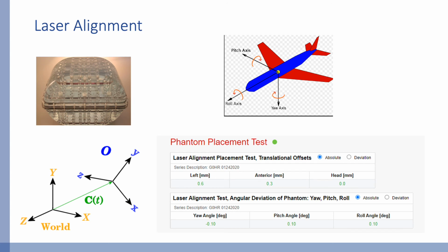The phantoms are equipped with precise alignment markings that enable the user to position the phantom at isocenter. The summary analysis outputs both the residual translational offset relative to isocenter and the rotational offset, letting the user know exactly where the phantom ended up and how it was oriented within the MR coordinate system. In combined MR therapy systems, the test can be used to ensure that some of the large moving parts in the system, such as a rotating gantry, do not influence the MR coordinate system.